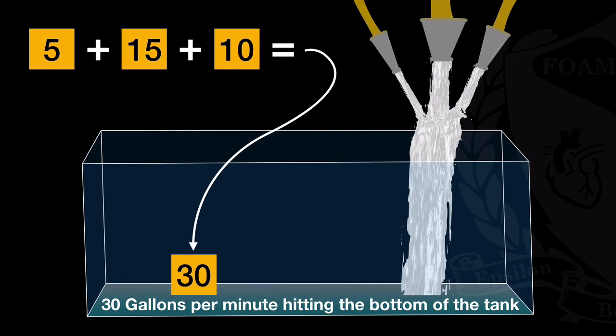Well, what about how fast the patient is breathing in? Well, that wasn't really what the question was about. I could put a drain in the bottom of this tank right here, and that's really not part of the equation. It matters to us how fast the patient is breathing in, but it actually doesn't affect this portion of the equation about how fast we are actually delivering the volume.